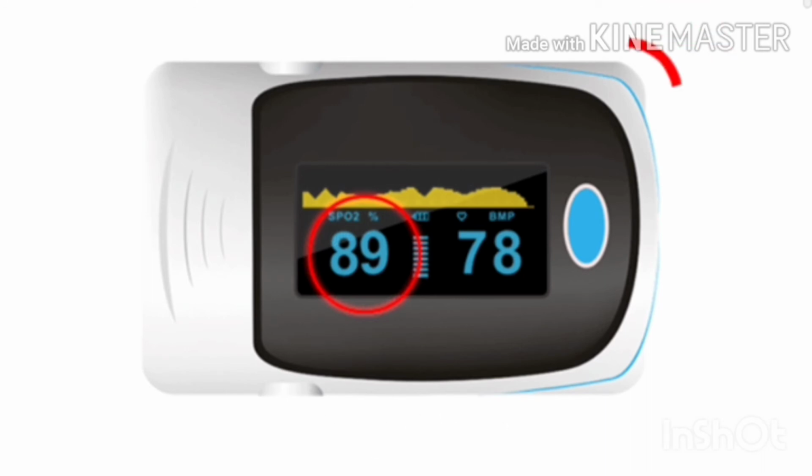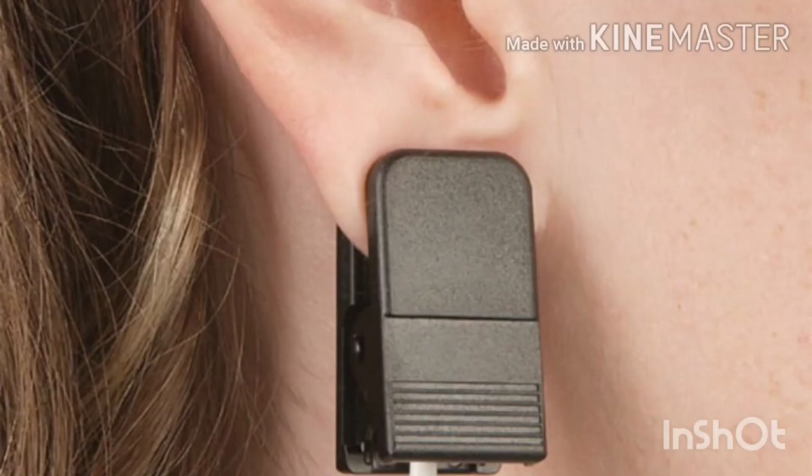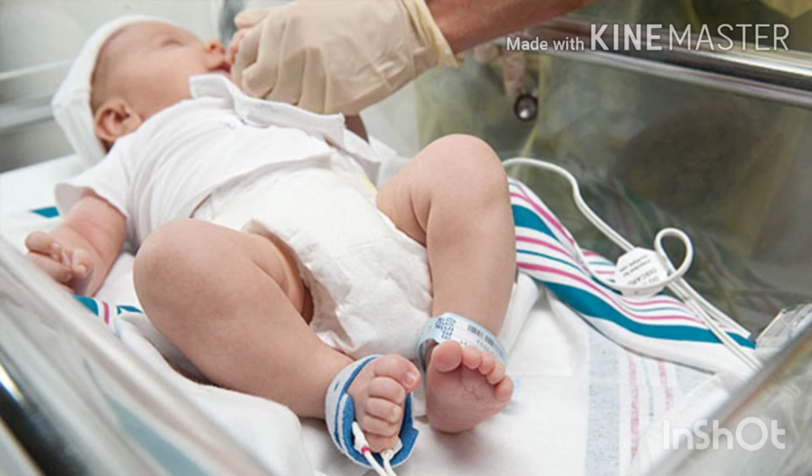Within 15 to 20 seconds, you will get a beep sound, and your oxygen saturation levels as well as the BPM, that is pulse rate, beats per minute, are displayed on the pulse oximeter. Not only on the finger, you can also place the pulse oximeter probe on the earlobes, palm or foot. The palm or foot approach is generally used in children.